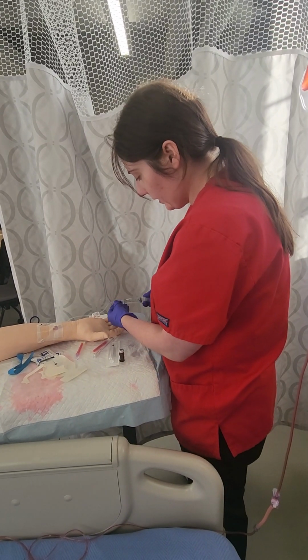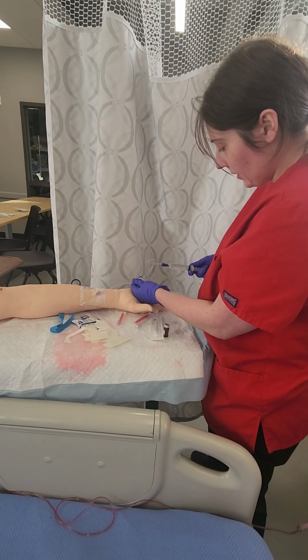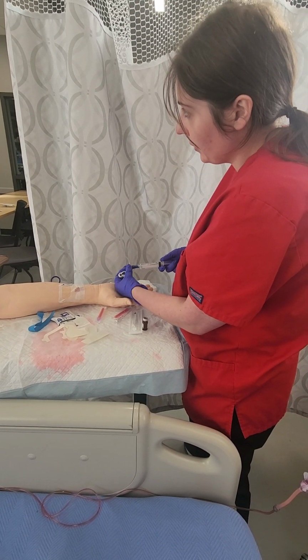Next, I'm going to take this and I'm going to aspirate, and I see some blood flow back, and now I'm going to push back about 3 mLs really slowly.